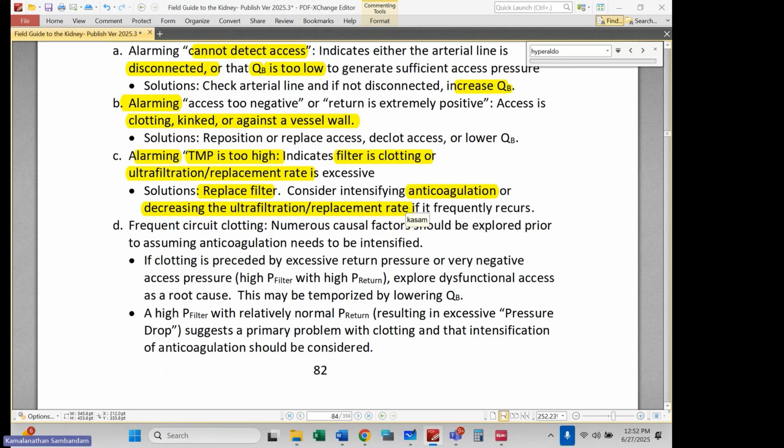Right? So if I want a net clearance of 3 liters, and I have 1.5 liters of dialysate flow rate, 1.5 liters of replacement fluid flow rate, and I still want 3 liters of total clearance, crank your dialysate up to 2 liters, put your replacement fluid down to 1 liter, or 2.5 liters and 500. Your blood flow rates are going to be more than enough generally. Remember, because your blood flow rate need only be 2.5 times my dialysate flow rates. Okay?